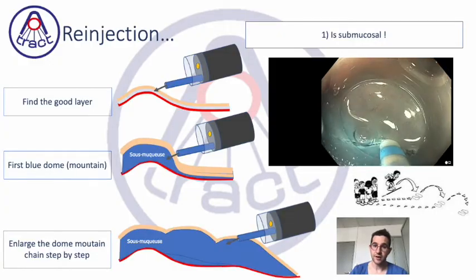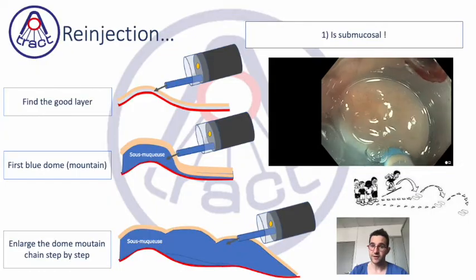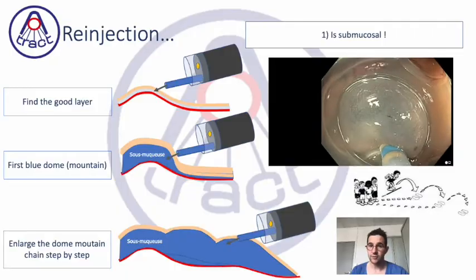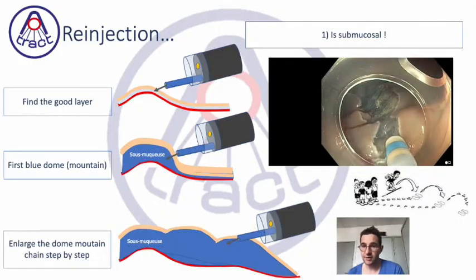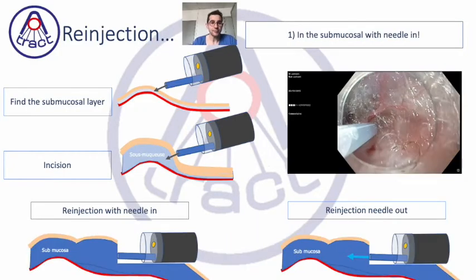And after, you can do your incision from an injected area, and if it's not injected, you can inject again with the knife. But the main message is, don't try to do the injection in a non-injected area, please use the area which has already been injected to enlarge the injected area.